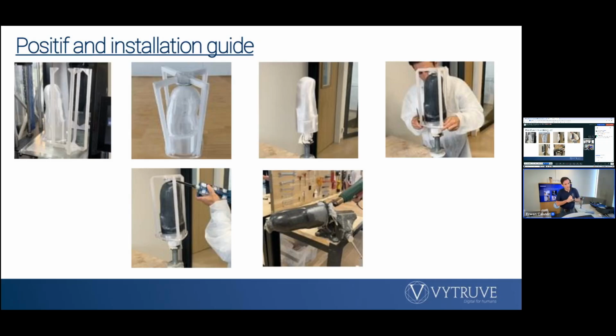So to sum up the process, you scan with the V-transfer plate, Vytruve, or you print in-house the positive and installation guide.